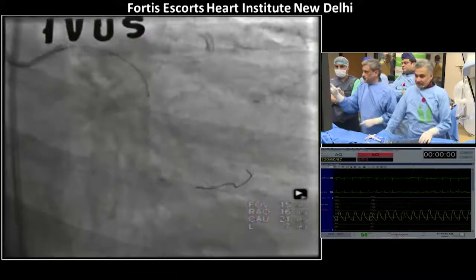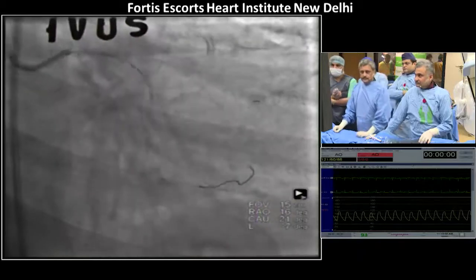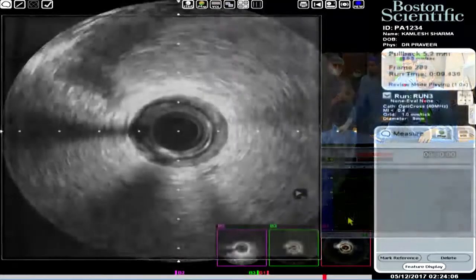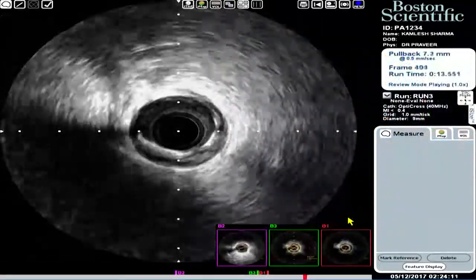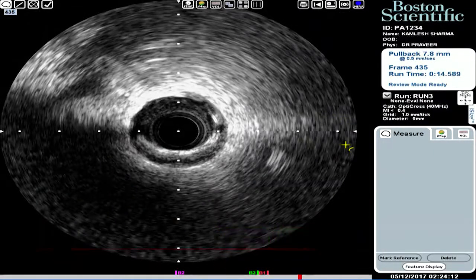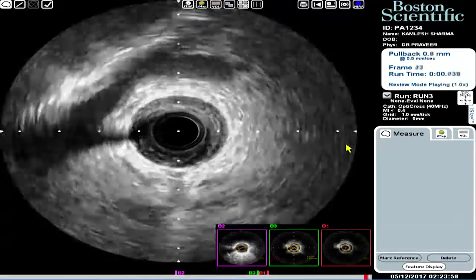Yes. Okay, you can go live. Want to speak? Can you show the IVUS, please? Yeah, restart the IVUS.